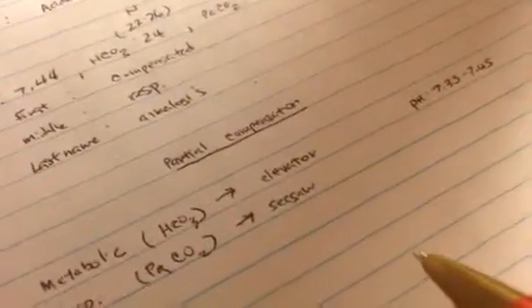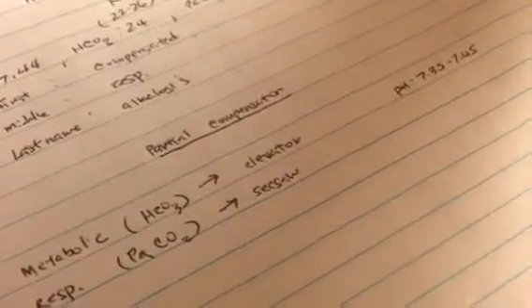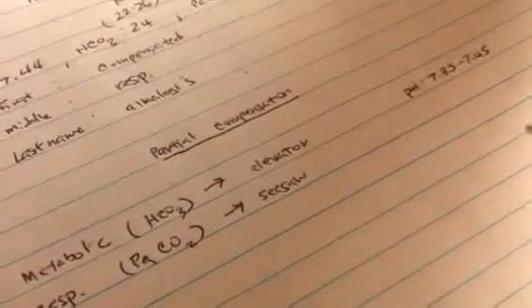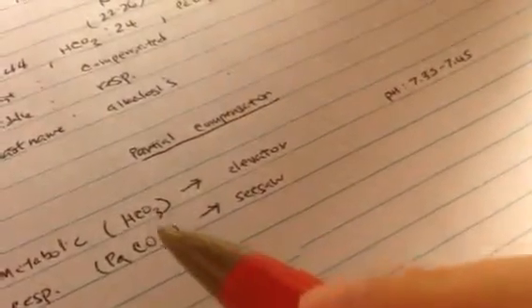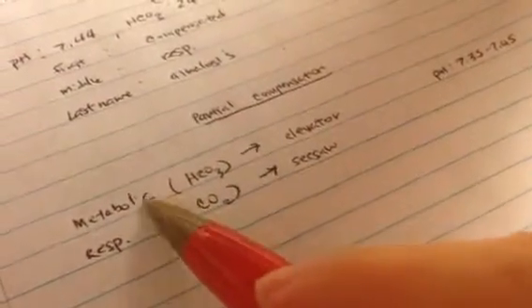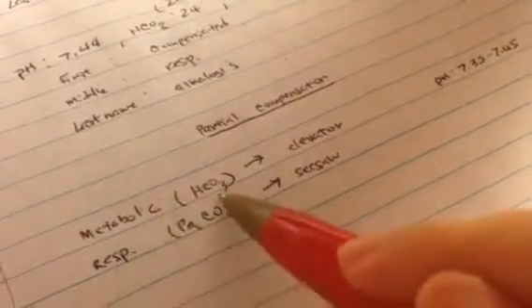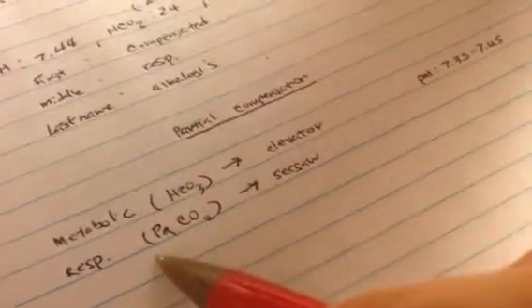Okay, so moving on, partial compensation. What if both your bicarb and your PaCO2 levels are abnormal? You can't do what we did in the last example in the first video. So in this case, we will compare both the bicarb and the PaCO2 to the pH. Now what I wrote here is that I'm comparing the metabolic, or the bicarb, similarly to an elevator, while the respiratory is more like a seesaw.